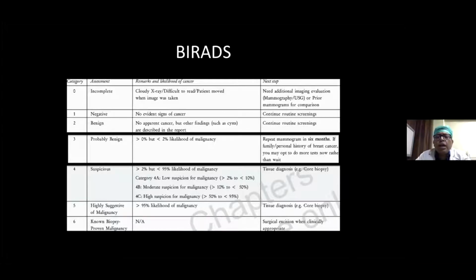And therefore, this is stamped as the Birads 3, which is called the probably benign lesions. And it would amount to a possibility of 2% likelihood of the lesion being malignant. And the standard recommendation is a follow-up at 6-monthly intervals, unless, of course, you feel that the patient has a strong familial predisposition, where you might need more frequent or longer duration of follow-up.